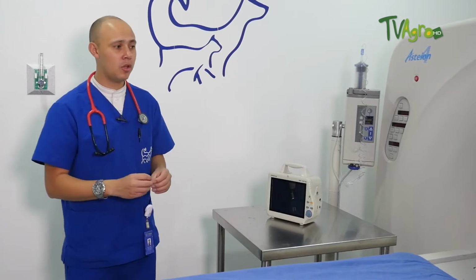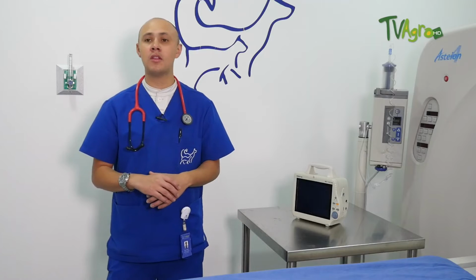The idea is to do the study and see whether that tumor is removable or not, and if it is removable, to enter fixed and safe so that the anesthetic procedure lasts as little as possible. It must be taken into account that in order to perform a study like this the patient must be under general anesthesia. It is not a procedure done with a sedated patient or with the patient on the table; it must be under general anesthesia.